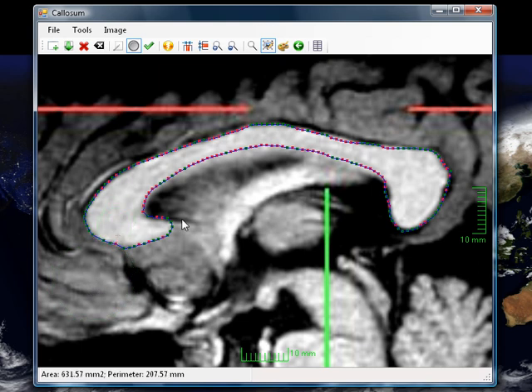So what do these red and the green points mean? Well, one of the limitations of the Denenberg algorithm is that it requires a convex path at the site of the terminal points of the center line. And if at the terminal point of the center line the path is concave, then you cannot calculate the callosal widths because they will fall outside of the region of interest.